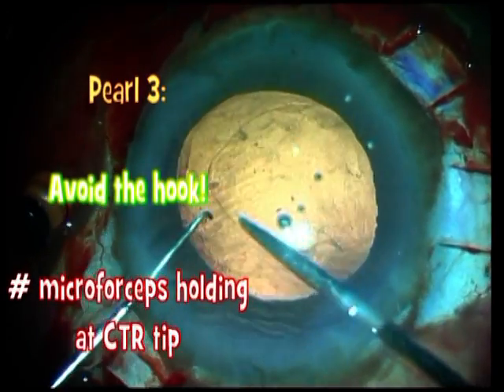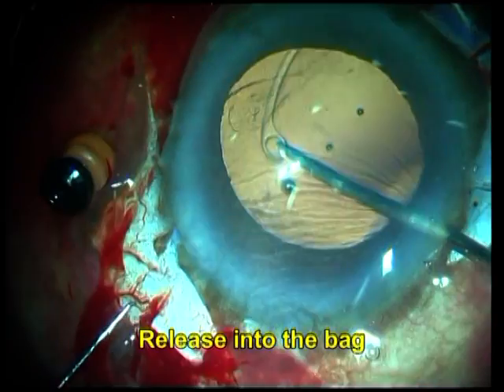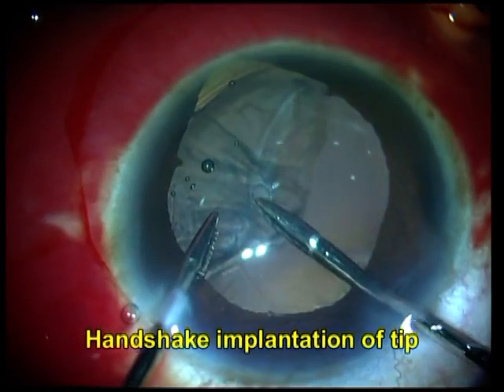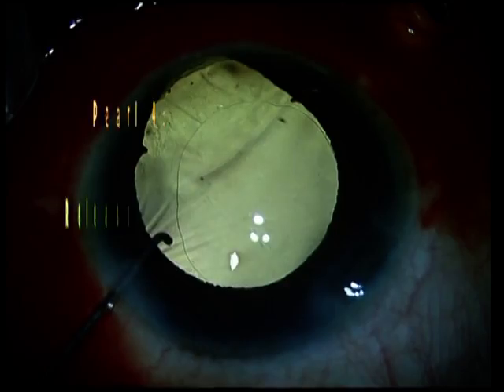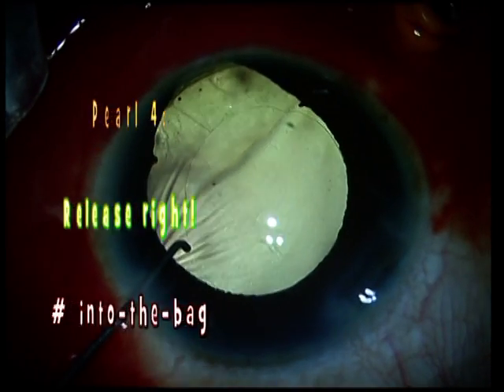Again a Sinski hook is being used and you can see that it's gone and again ended in an uncontrolled manner — this time it's gone over the sulcus. On the other hand, you can see here a handshake technique using two micro forceps being used to accurately guide the CTR into the bag. Pearl number 4 is exactly that: release the CTR using micro forceps and the handshake technique if required into the bag.